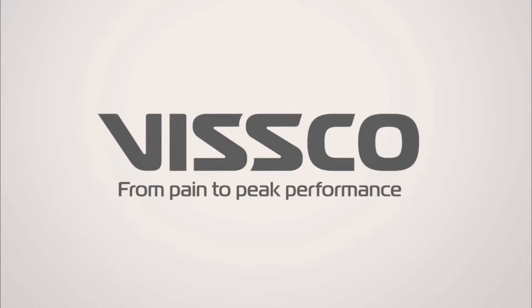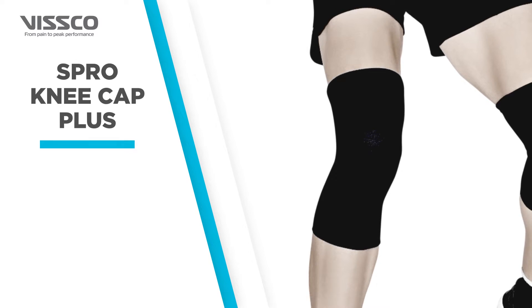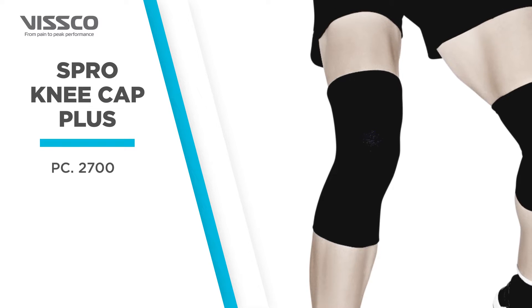Greetings from Vissco. Let us now see how to wear the Vissco Spro Knee Cap Plus, Product Code 2700.